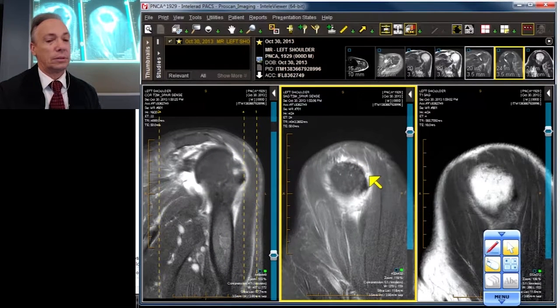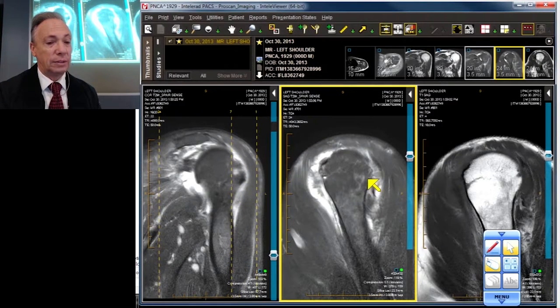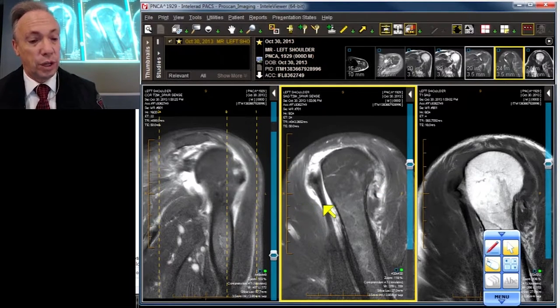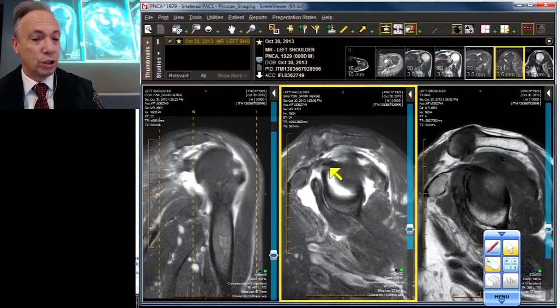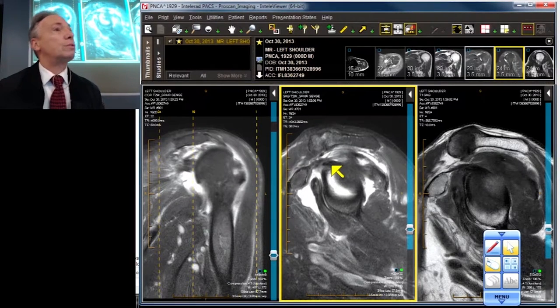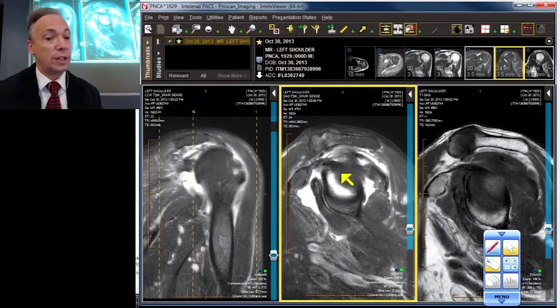Let's continue scrolling. Going out to the side — we've got nothing, a little bit of teres. We start working our way in and still nothing. We should be running into the biceps about now, and we do — right there, there's our biceps. Let's follow it: our biceps is present and accounted for, though it's also subluxed — but that's a story for a different vignette.